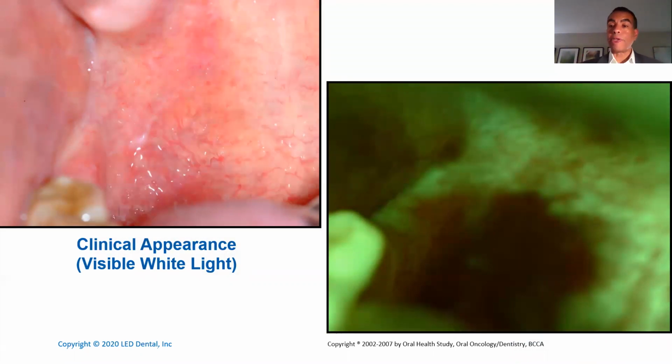It's really important. How do we know it's not changed shape or size? Because we took a picture of that lesion the first visit. When they came back, we took another one and we were able to compare the pictures to say this has not shrunken, if you will, at all. And then lastly, in both visits, it did not blanch at all either. So at that point, we're left with, I don't know what it is, and this requires further follow-up.